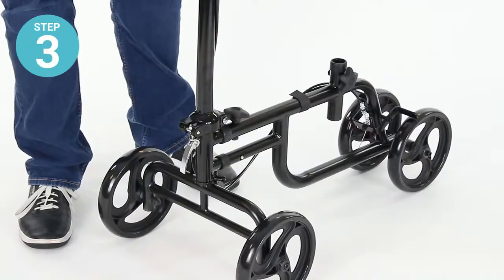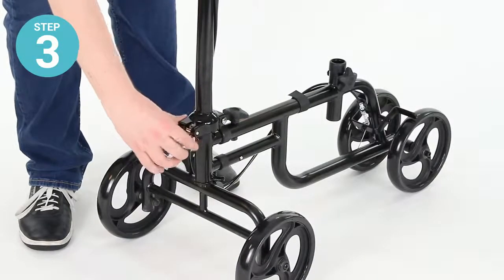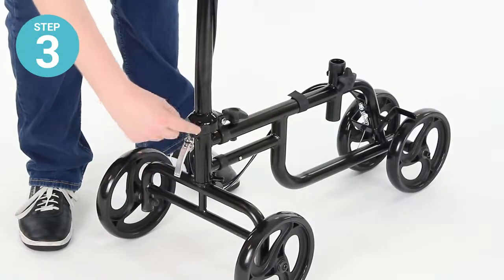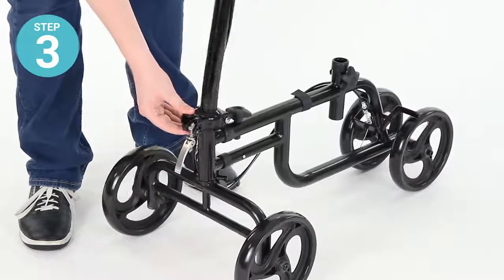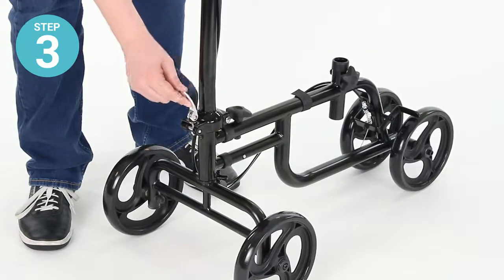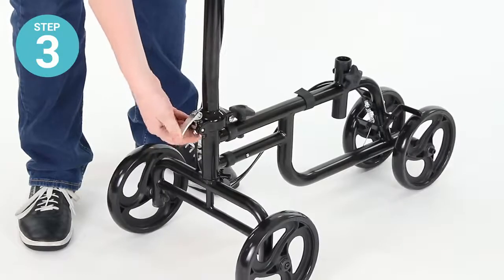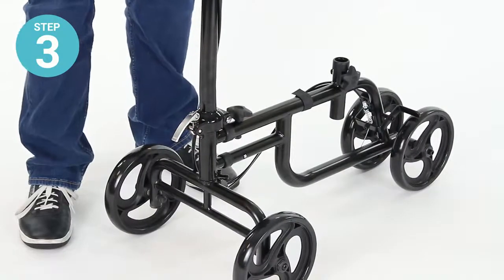Step three: make sure that the steering column is brought into a vertical position so that the locking pin will latch into place. Bring that up until it clicks into place. Then lift the tension lever assembly up and lower just the tension bolt down until there's pressure applied to the hinge to secure the steering column.